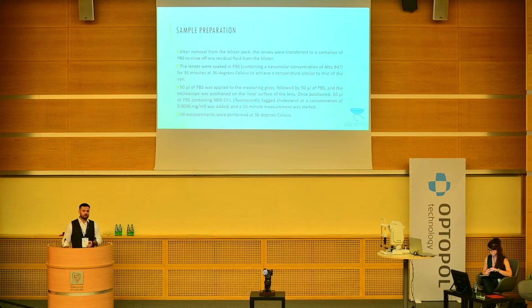So what we've done differently than other research in this area is that we do not use surfactants to dissolve the lipids very well into the solution. So we allow the lipid to make some kind of agglomeration. We did not control it, but actually we cannot control the lipids, and we don't know how they behave on the lens, on the eye surface, perfectly.